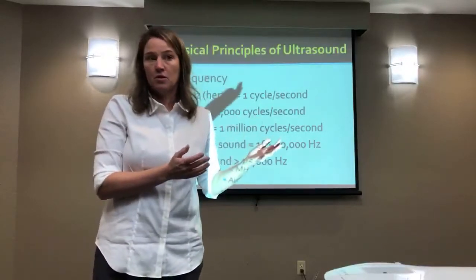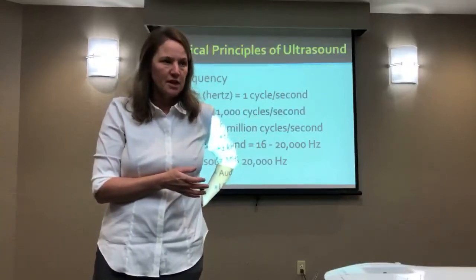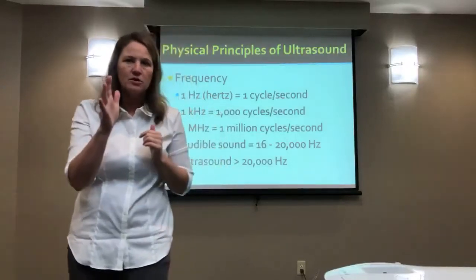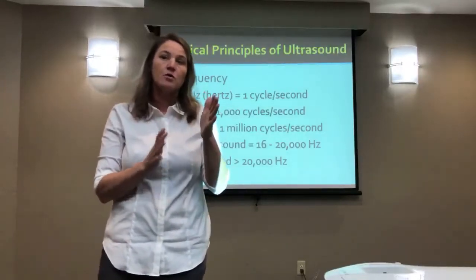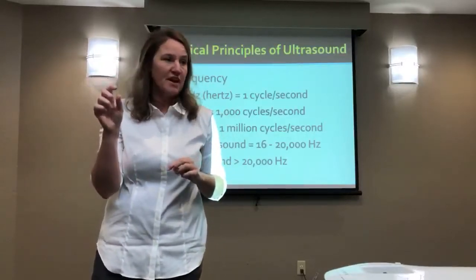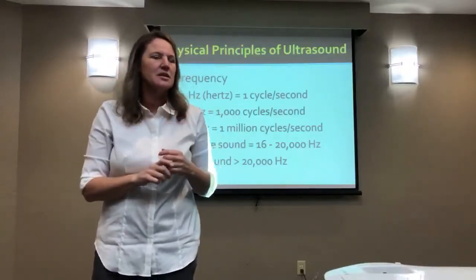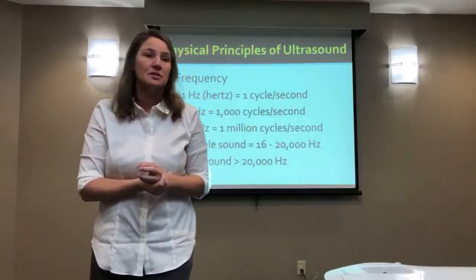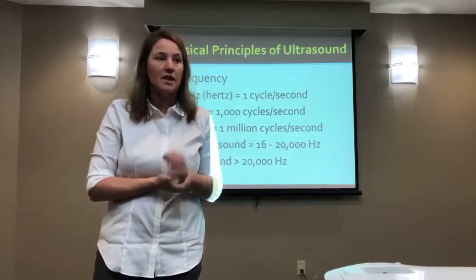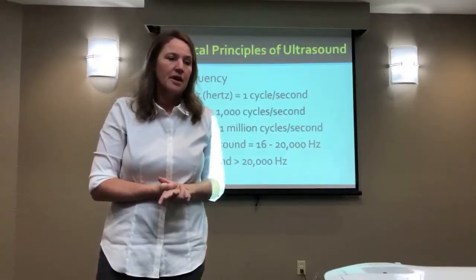More typically though, what we're going to be talking about today is millions of cycles per second. So from 1 to 3 million cycles per second, 1 megahertz and 3 megahertz are the most common, but you may see a slight variation when you look at different manufacturers. They may be right around that range, but just slightly different. Simply, probably just to make themselves unique, but there may be some reason that they give why they go slightly above or slightly below what other people are typically selling.